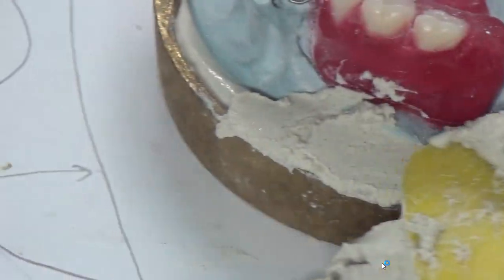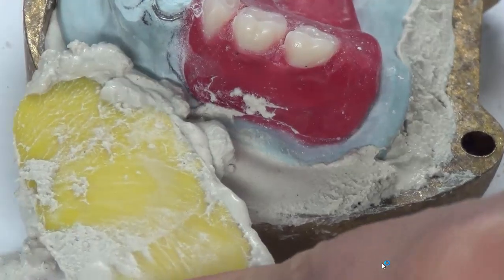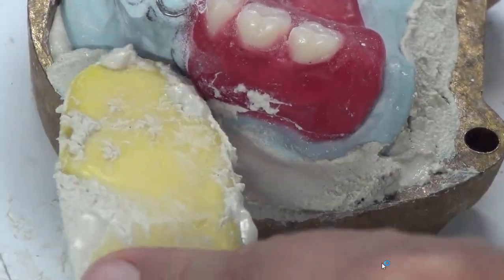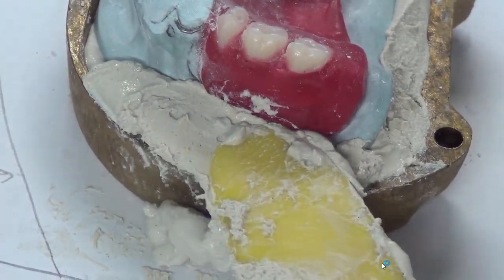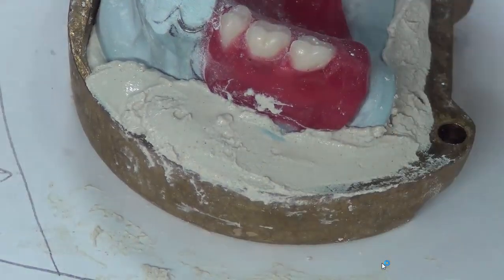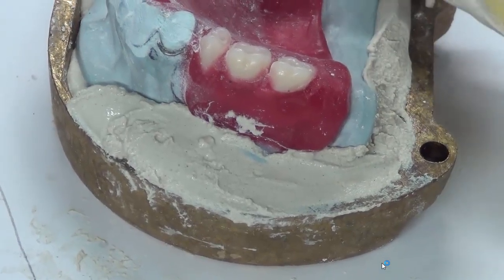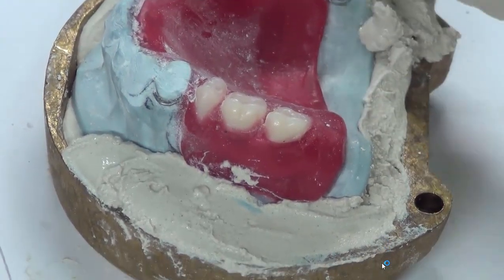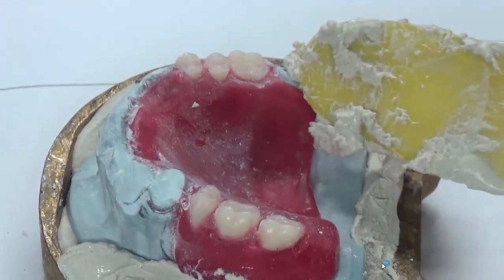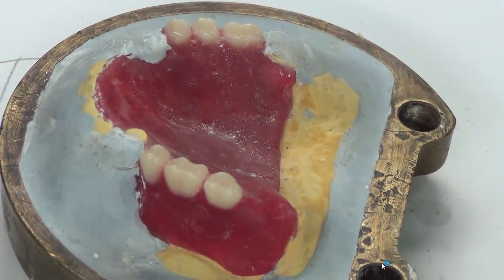Then we begin adding plaster, covering all parts of the cast except the wax. So we're going to begin like this. All parts that are not included in the wax up, we're going to cover them. We're going to add also plaster over the teeth that we cut. So the only thing that we will leave exposed from this flask once we finish is the wax area. So it will become like this.